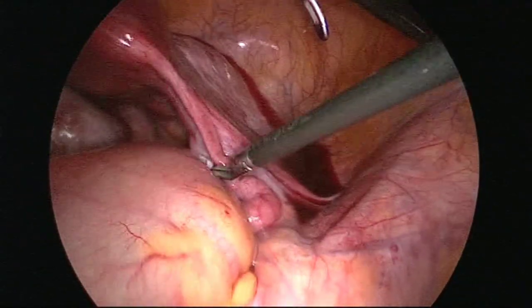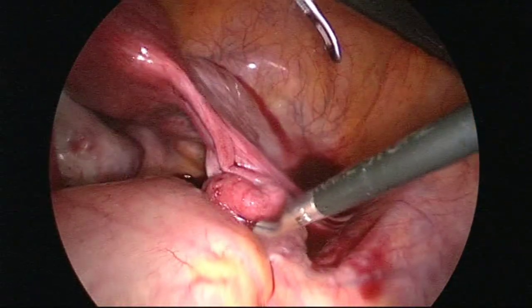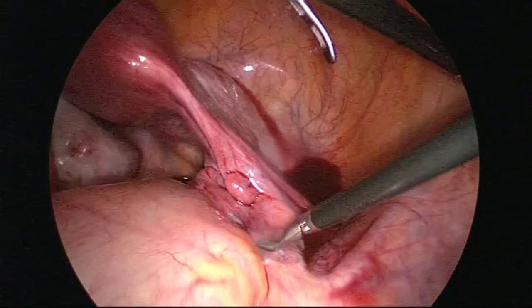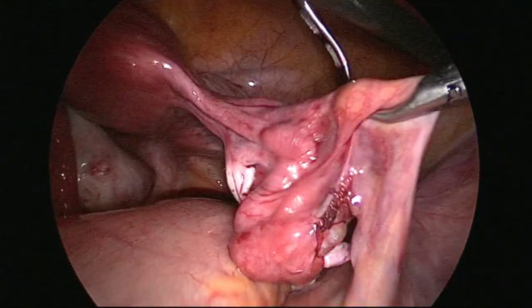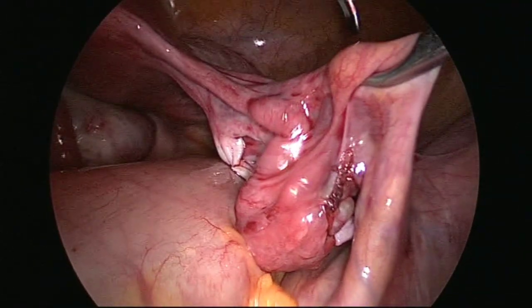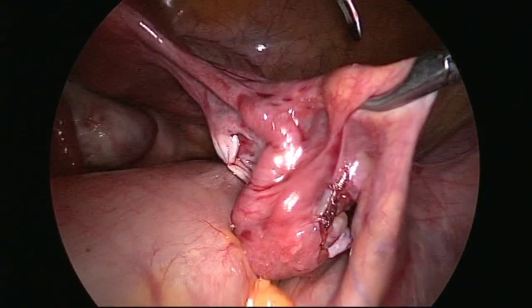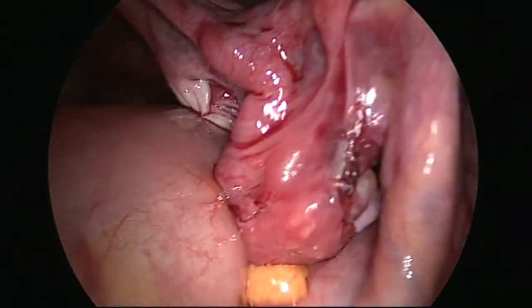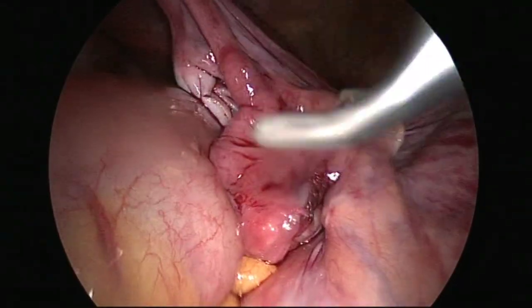Now coming to the right side, this tube is looking unhealthy. I don't think it will be open. Okay, you can see there is a distance. Now my assistant is pushing the dye and there is no filling at all.